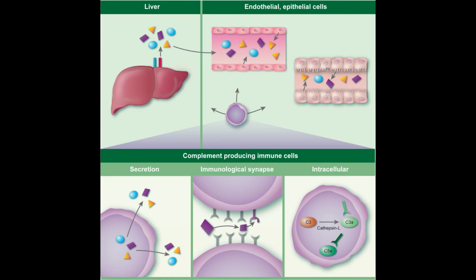Table 6-5 presents some of the possible screening results from ELISA testing and correlates this with deficiency of individual factors. An understanding of this pattern may be helpful in differentiating hereditary deficiency from activational states that consume available complement components. Additional testing would be necessary, however, to actually pinpoint hereditary deficiencies.